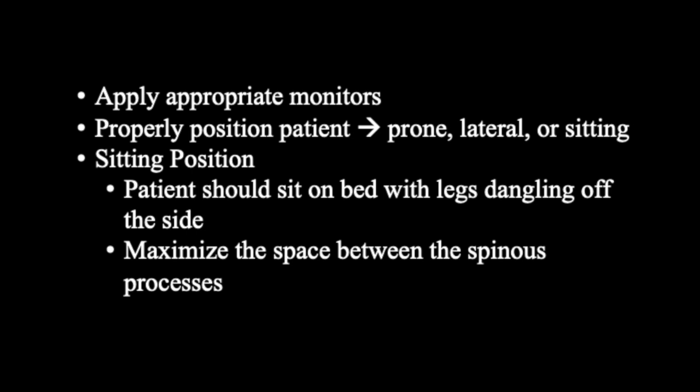Be sure to check patient lab values, specifically platelet level. The lower accepted level will vary from institution to institution. Obtain patient consent. Apply appropriate monitors.